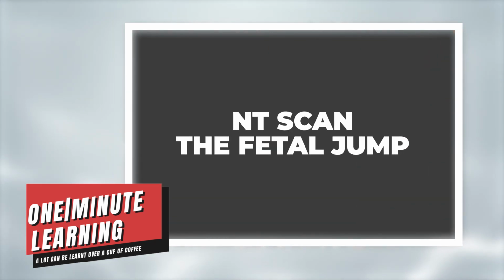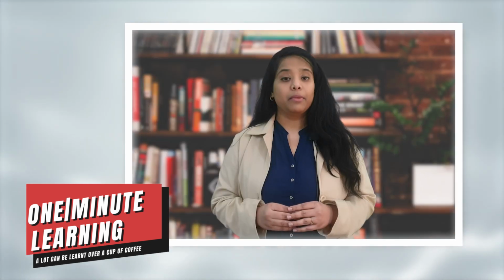I am your host Khushbu and today's topic is NT scan and the fetal jump. NT scan, or nuchal translucency, is a sonographic appearance of subcutaneous accumulation of fluid behind the fetal neck. But do you know? Along with following the scanning protocol of NT examination in ultrasound, the fetal jump plays an extremely important role in examining the correct NT.